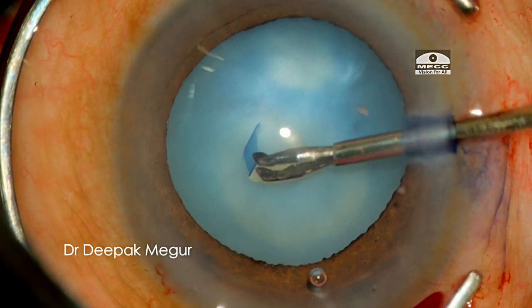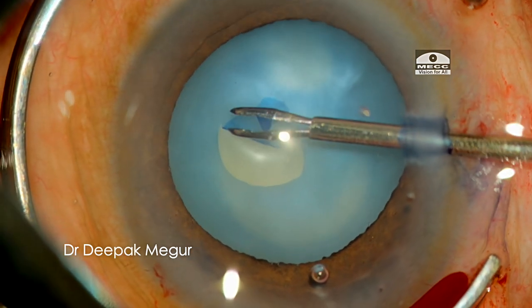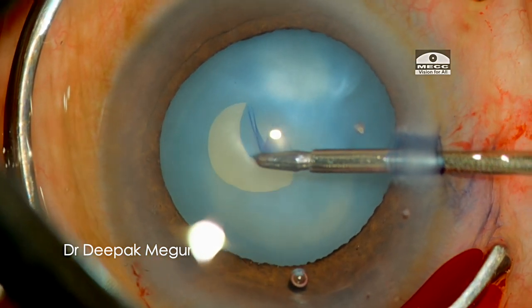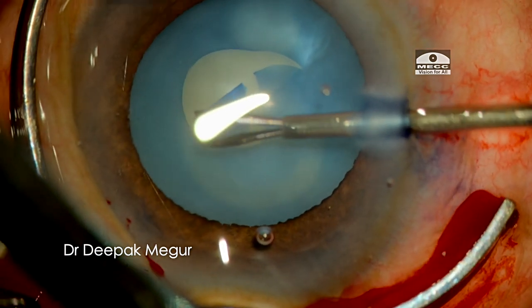I am using micro forceps through the side port to minimize any escape of OVD. My plan is to do a two-stage rhexis — make an initial small one. I am trying to keep the flap as flat as possible and not fold it, but unfortunately the capsule sticks onto the forceps resulting in an uncontrolled tear. I should have stopped, gone back, filled the chamber with more OVD, and refocused on getting a small primary rhexis.